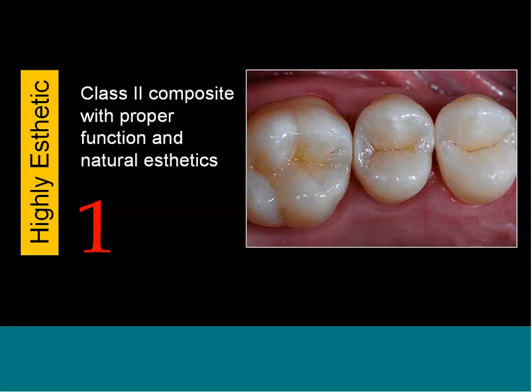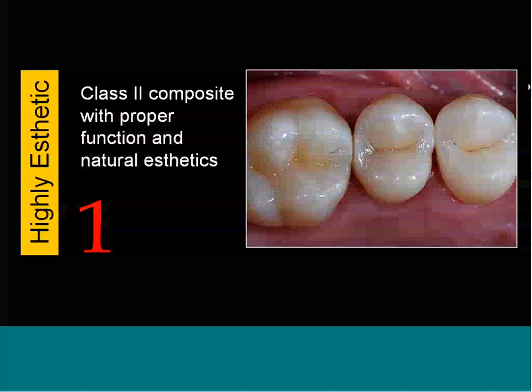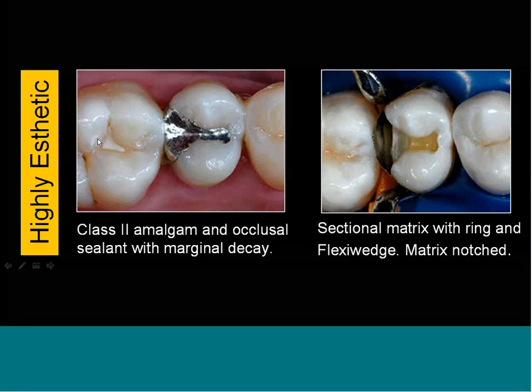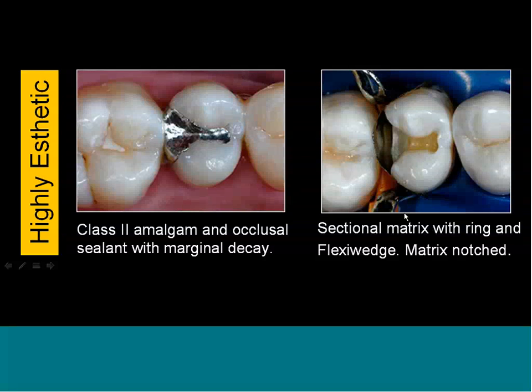But in this case, he wanted me to take pictures, he wanted to see what things look like. So this is more a function of A, using Elite, which is a very aesthetic composite, and B, spending more time for this patient. So he had an old sealant and an old amalgam. There's the old sealant, there's the old amalgam. You take those out, and this is an older sectional matrix from the older Garrisons with a wedge put in.